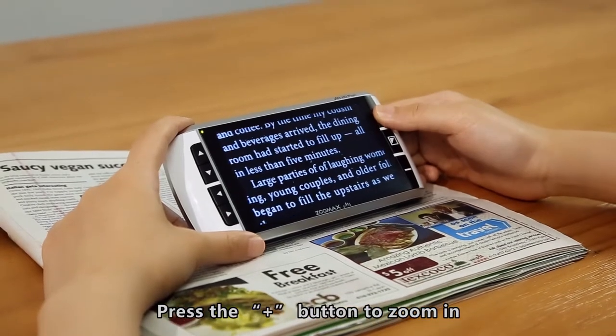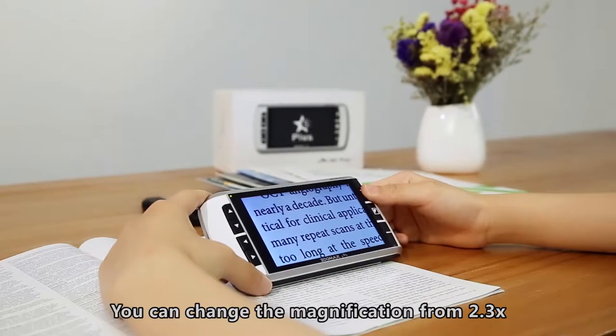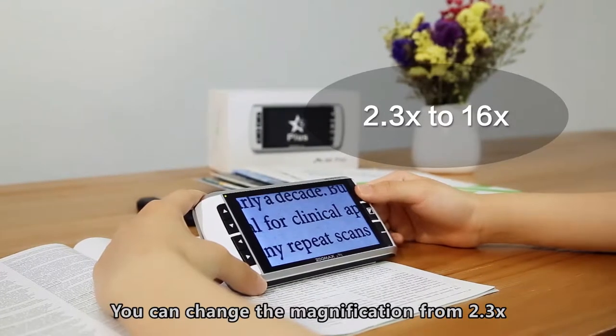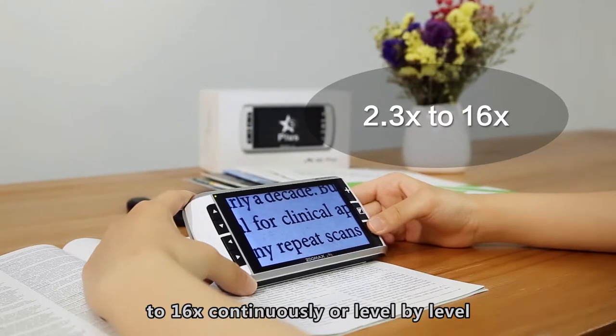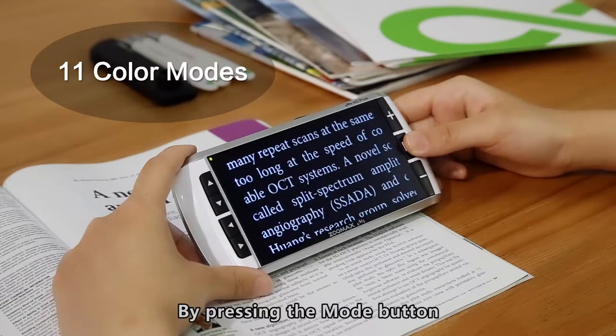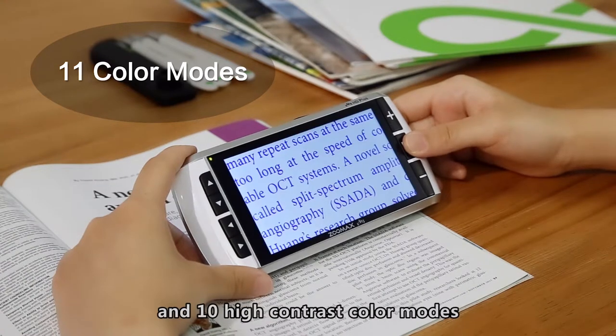the M5HD+ provides you with an incredible crystal clear image suitable for any age group. Press the Zoom In button to zoom in and press the Zoom Out button to zoom out. You can change the magnification from 2.3 times to 16 times continuously or level by level. By pressing the Mode button, you can cycle through full color and 10 high contrast color modes.